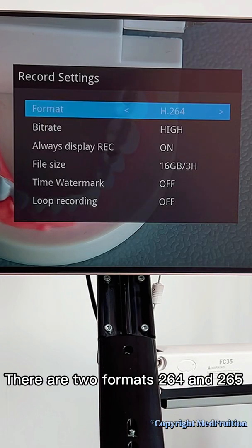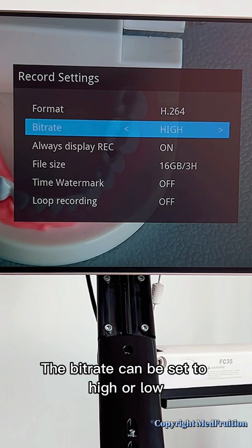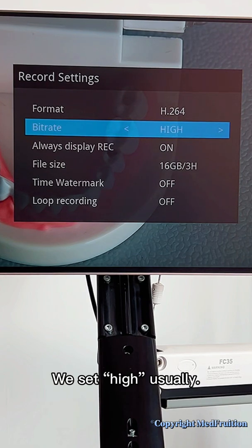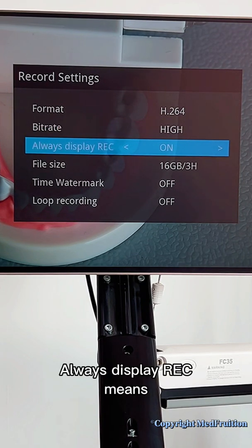There are two formats: H.264 and H.265. The bitrate can be set to high or low. We usually set it to high.